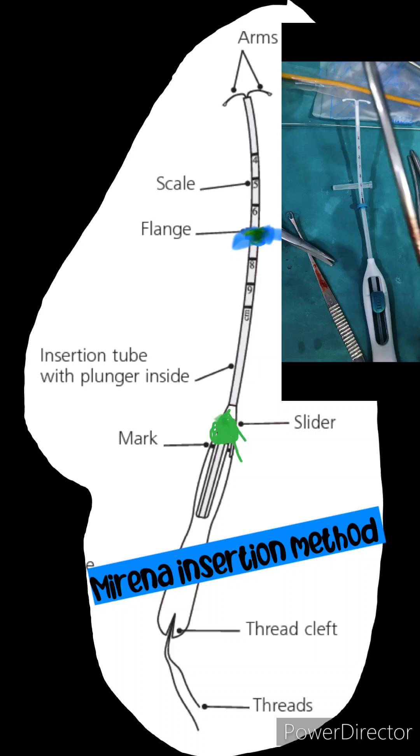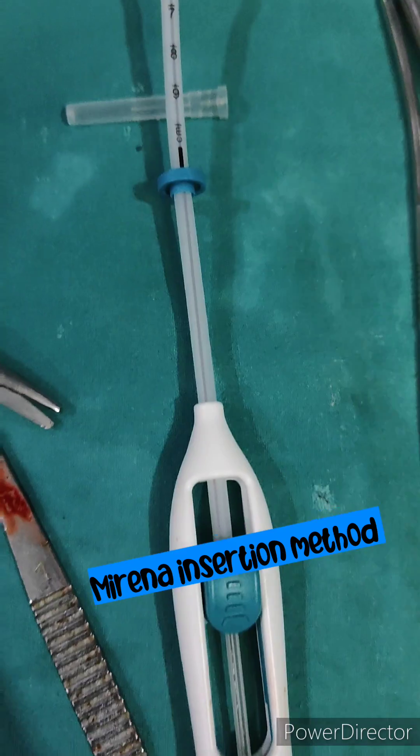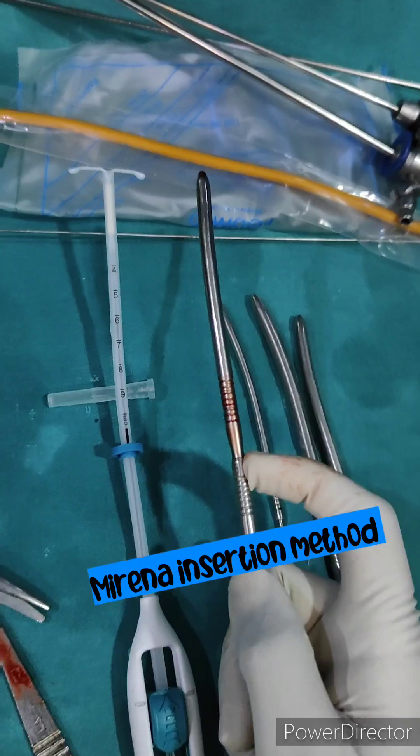At that mark there is the Mirena. After opening the pack, you should lie down the patient in the supine position after passing urine. Now you should take the UCL — usually the uterocervical length — so you can adjust the flange according to that patient.